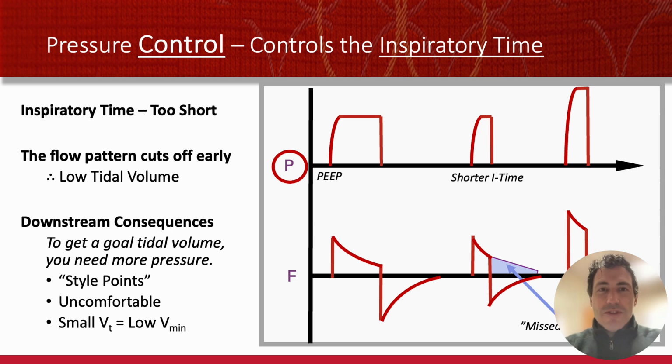A lot of us intensivists disagree on how far out you want to breathe for patients, like what inspiratory time you should target. In general, if I call that peak 100% and I try to watch the flow pattern once it gets down to around 25%, that's normally good, where I'm getting the bulk of free tidal volume and I'm still allowing time to breathe out. If I go up on my inspiratory time on this last breath, I'll get a little bigger breath, but not that much. A little bit of diminishing returns. So I aim around 25%. Other people disagree. That's okay too.